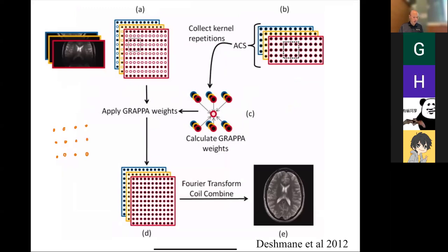Right. Let's say, and we talked about this, if I have to go and collect all those points, it's going to take a lot of time. But if I know I blurred out the data, then I know these are not independent. Blurring, remember, means any given point depends on the contributions of lots of other points. So this point here depends on all these other points, because of the blurring.